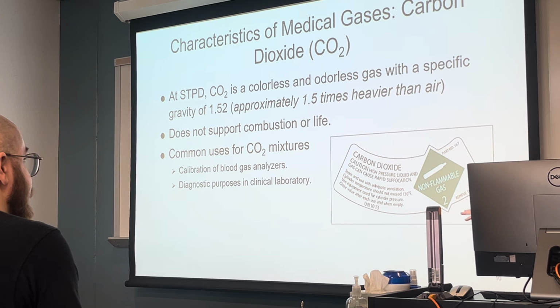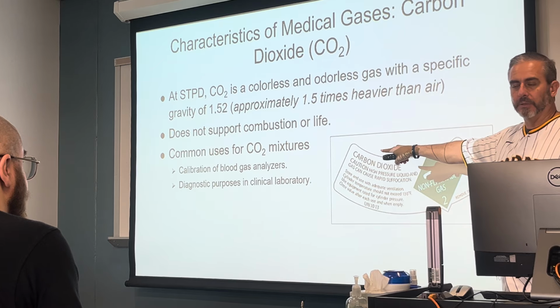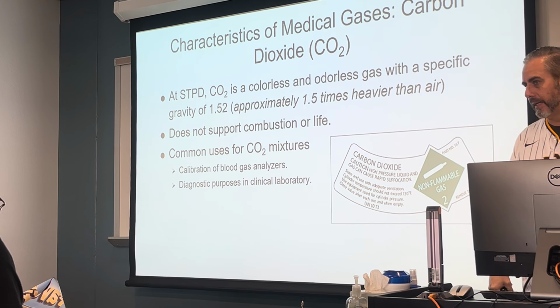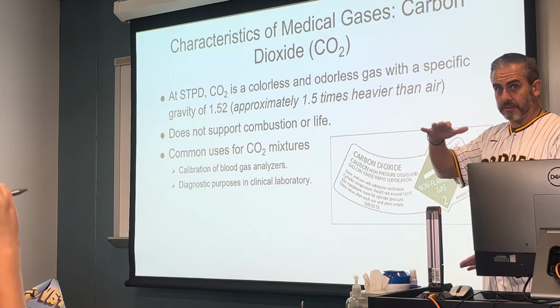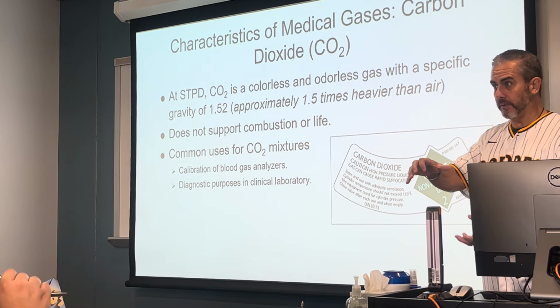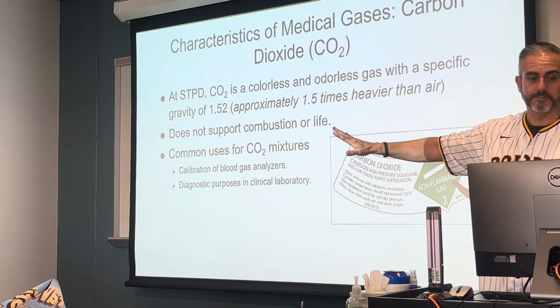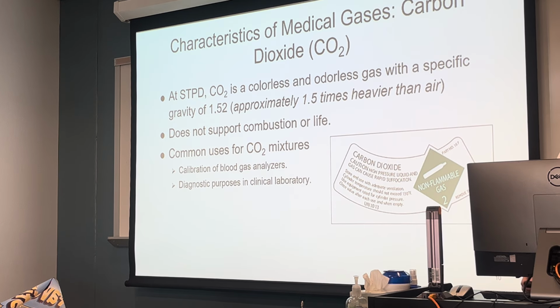Well, where do we use this? Most common uses are in the blood gas laboratory, calibration of blood gas analyzers, and also in a pulmonary function lab setting. So you will encounter tanks of CO2, and again, recognize we're not taking these tanks and putting patients on pure carbon dioxide. Of course, we would suffocate someone if we did that.